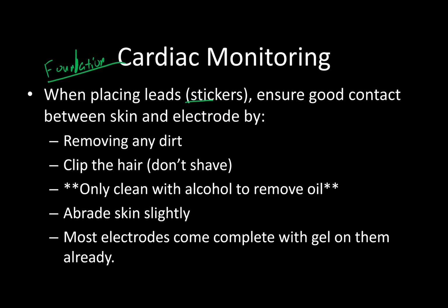So the absolute most important things you need to do whenever you're placing them, from the very start, is, of course, removing any dirt. It's kind of a given. Clip the hair. Don't shave them, but get the clippers out. Get that chest hair out of the way. It's just going to make a big difference. Don't clean with alcohol pads unless they have really oily skin. You don't want to mess with that because then the skin gets dry and it doesn't work well.